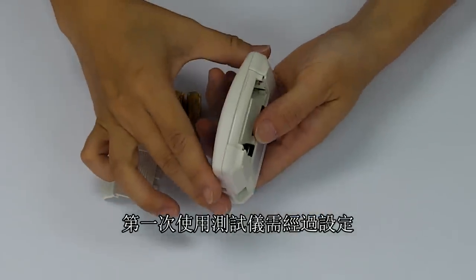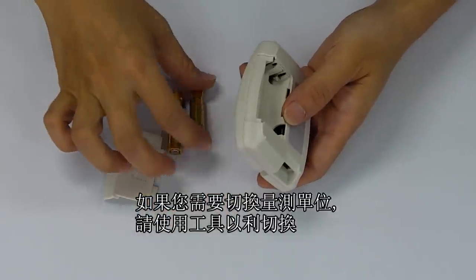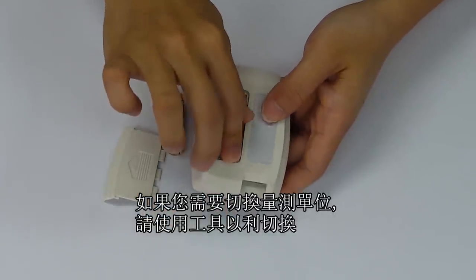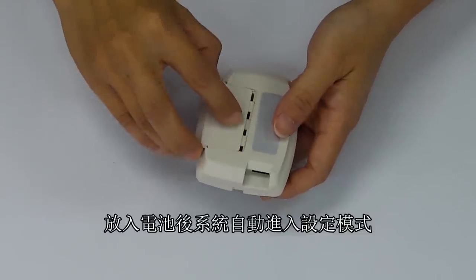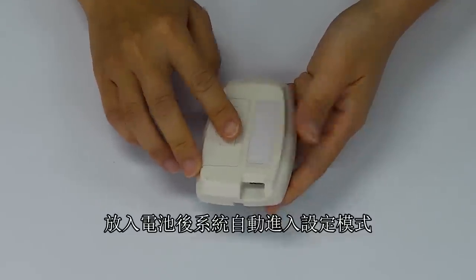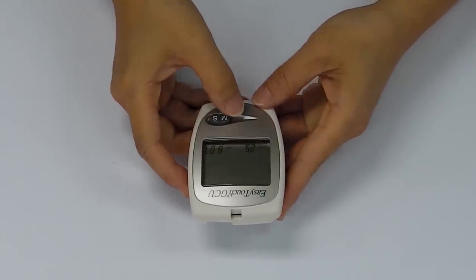Your meter needs to be set up the first time you use it. If you wish to change the unit setting, flip the unit setting switch in the battery compartment. After you insert two AAA alkaline batteries, the meter enters setting mode.